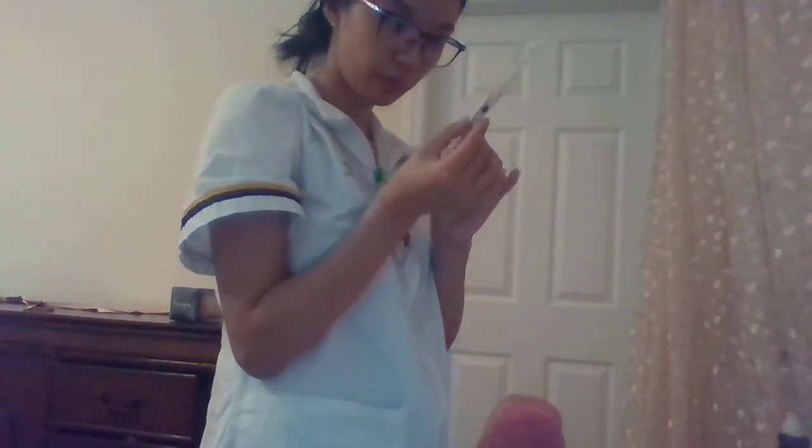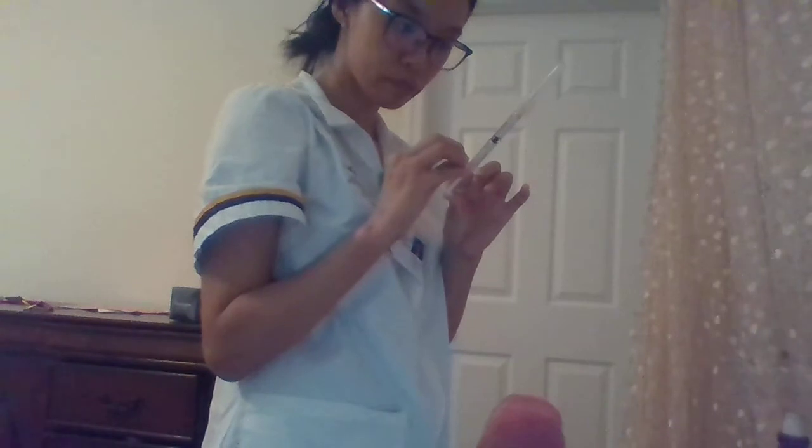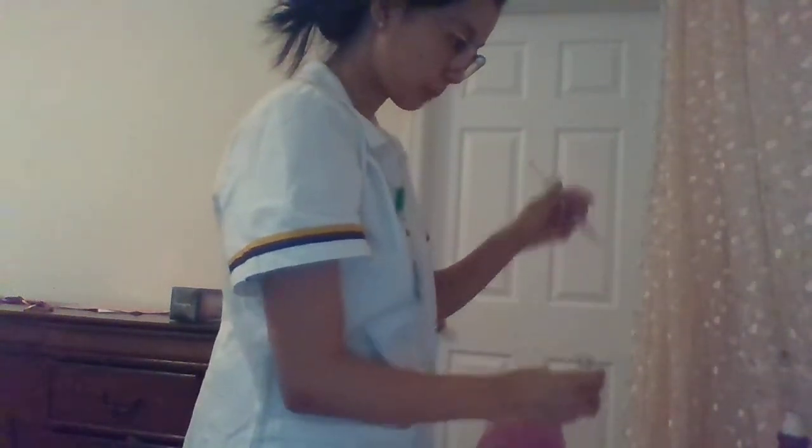So I'm going to draw back 0.5 ml. And I'm going to insert the needle into the vial to withdraw the appropriate dose of the medication. I'm going to inject the air into the vial.